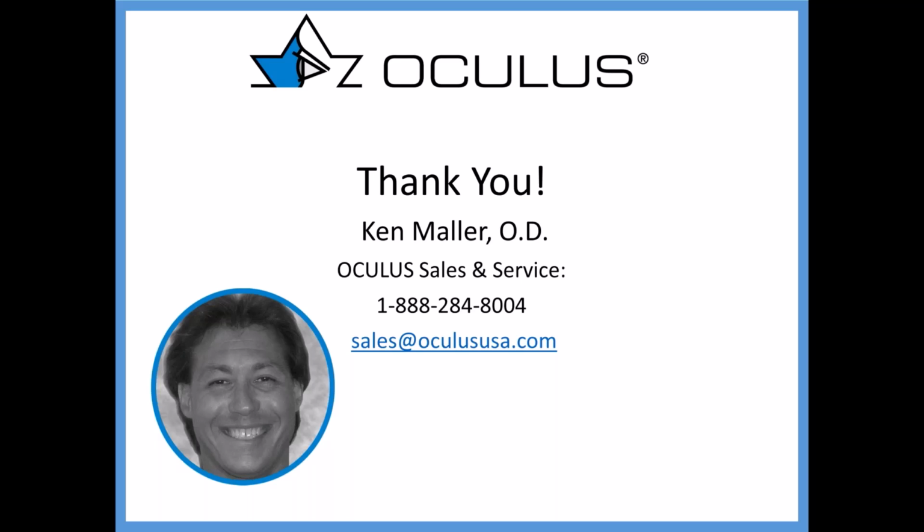On case number 1, Ken, your calculation of the power of the lens, did you utilize your manifest refraction, the aberrometry refraction, or trial lens? How did you calculate the power?